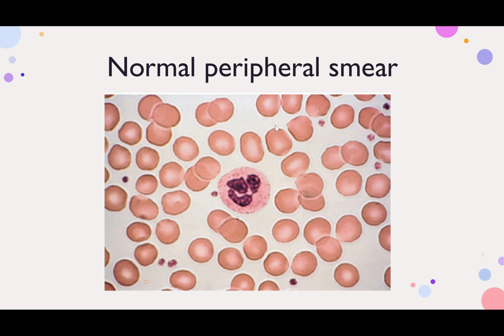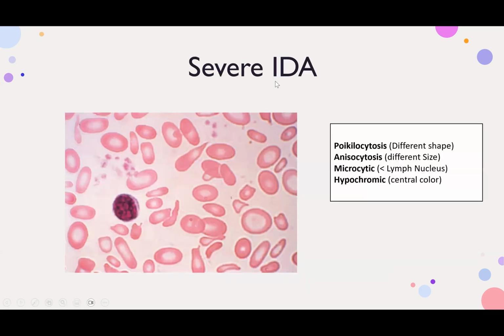And if you have a decrease in the central pallor, like this RBC, for example, or this one, those 3 RBCs here, it means this is spherocytosis. Okay? So normally you should have RBCs like this one with mild central pallor. Okay? Now, severe iron deficiency anemia. Look at the central pallor here. It's increased, right? Central pallor here is more.